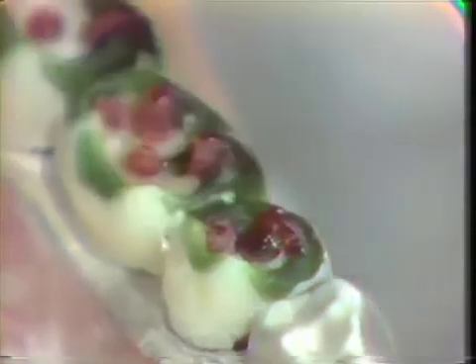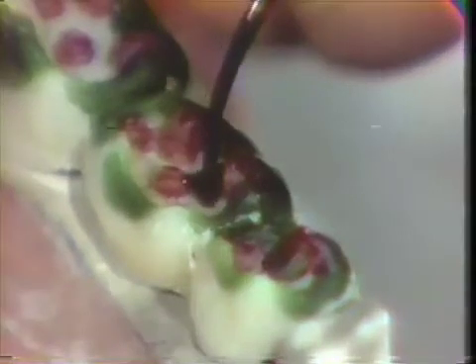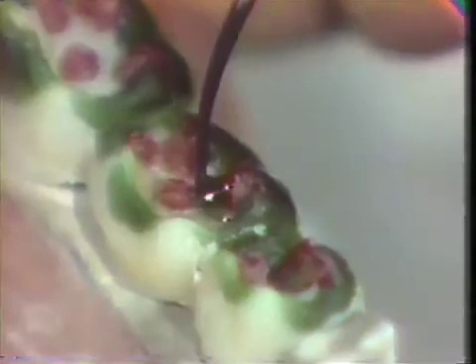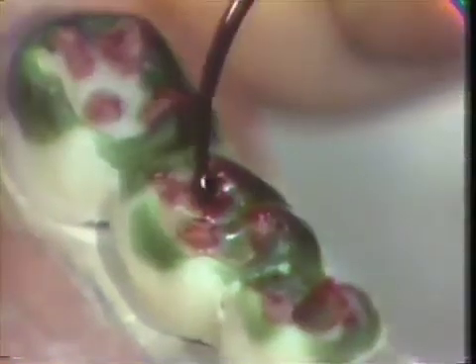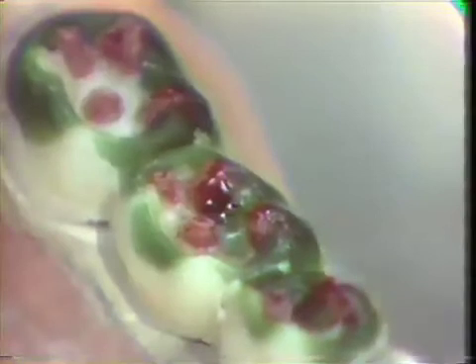It's good to recall that the shape of the triangular ridge is somewhat of a teardrop, with the base being wider down toward the central developmental groove than the area near the tip of the cusp. We'll go ahead and complete these triangular ridges, and therefore complete step number 5 of our wax-up.